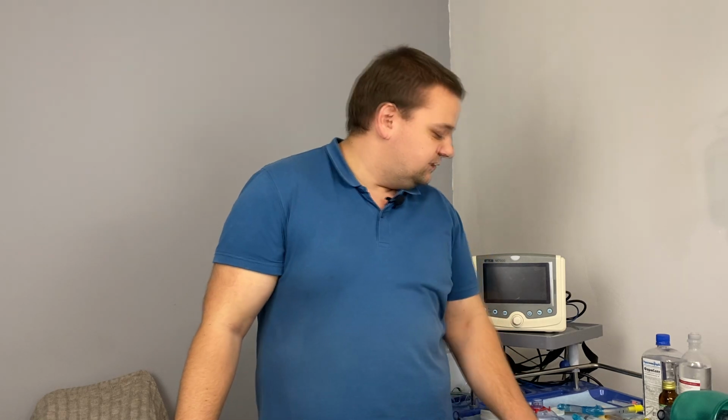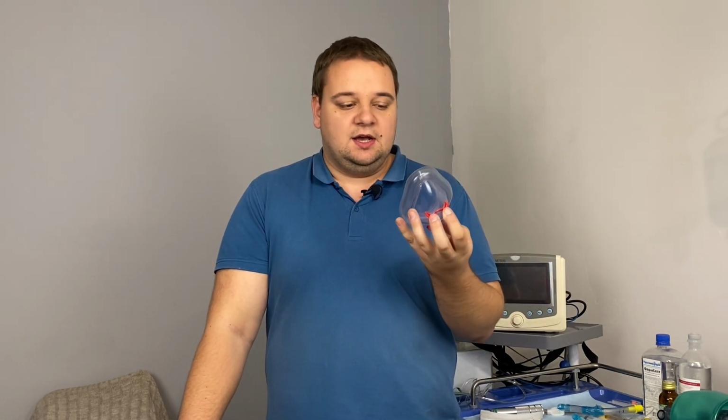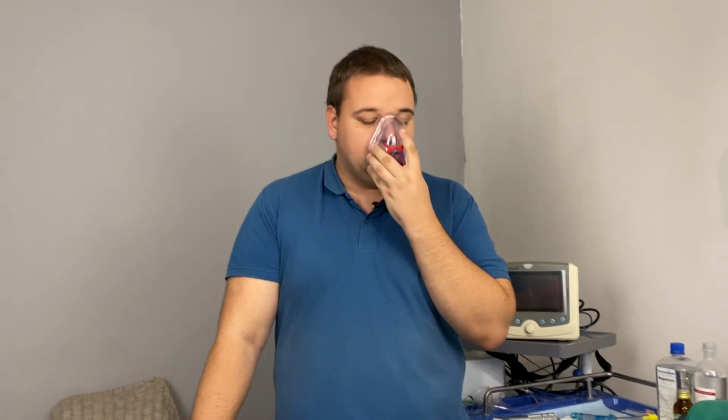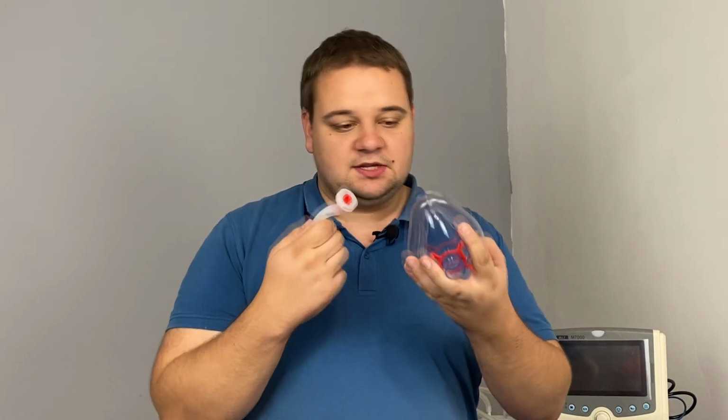Now, this is for the tubes, also for the devices that we use for ventilation itself. We can use the face mask, of course. We can use it without any device, just applying that on the face of the patient. And we can use that together with the oropharyngeal tube. You see that it doesn't have a connector which is present in other devices. That's why we can only ventilate a patient with this device using the face mask.